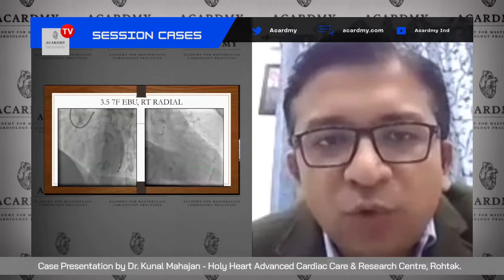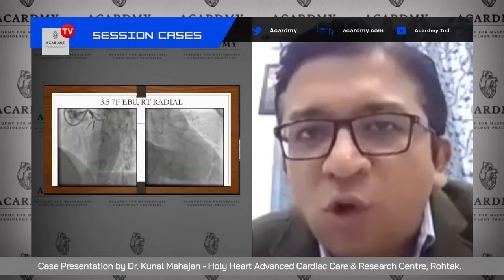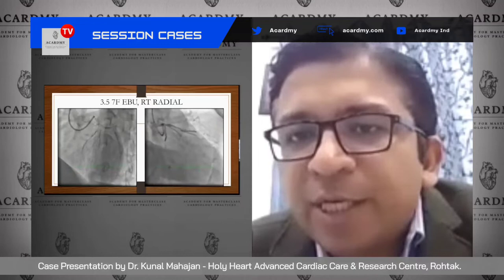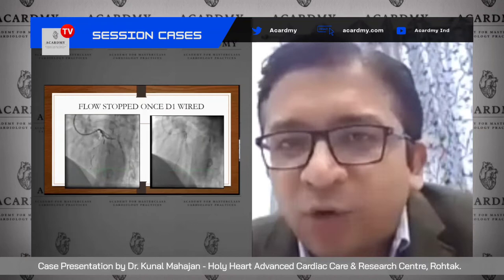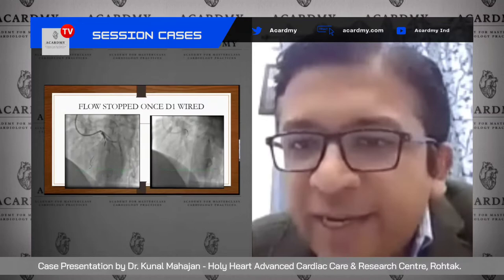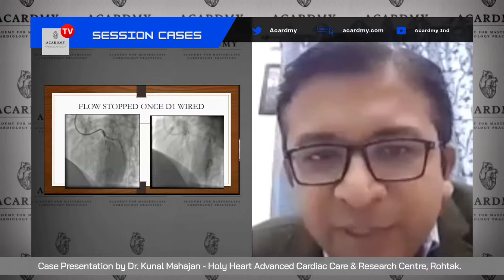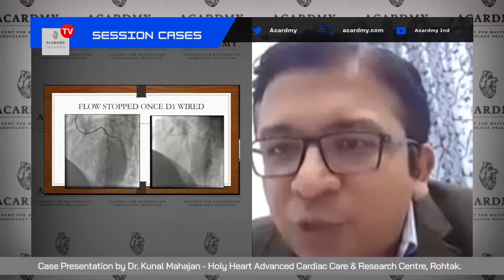With the guiding catheter in place, we re-shot the LAD and could see that flow had further compromised — probably the cause of worsening symptoms. The LAD ostium was also diseased. As soon as we passed a wire into the diagonal, the disease was so tight across the bifurcation that flow in the LAD absolutely stopped. We had a hard time rewiring the LAD and had to use balloon support. As an emergency measure — the patient started having chest pain and ECG changes — we pushed the wire with balloon support into the LAD as a last resort.